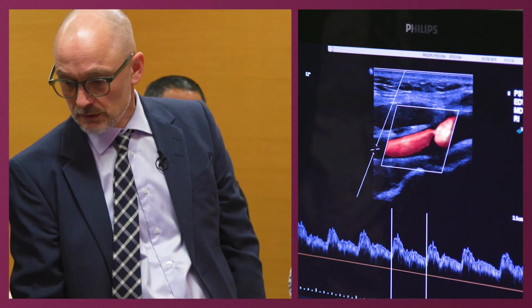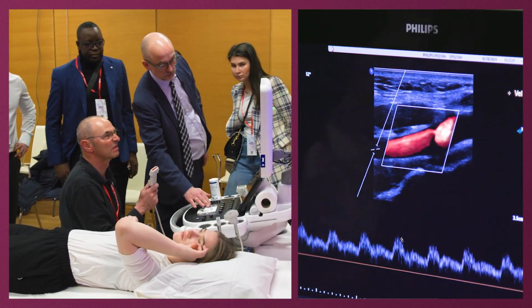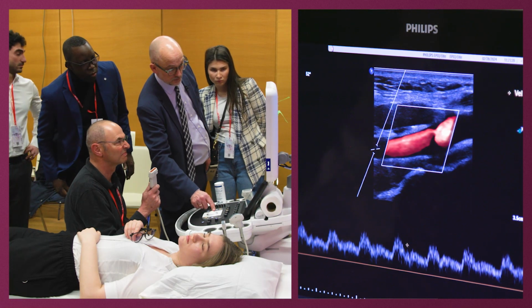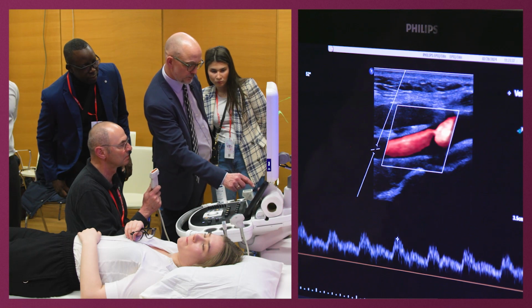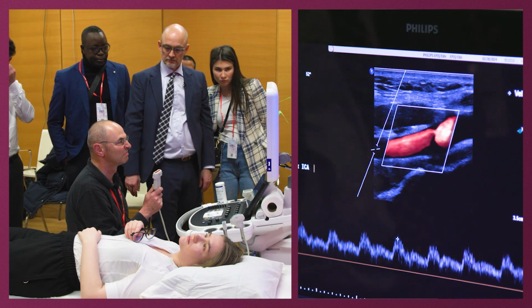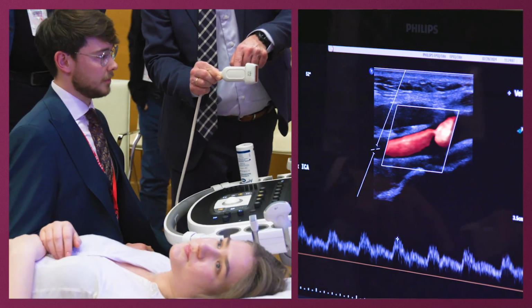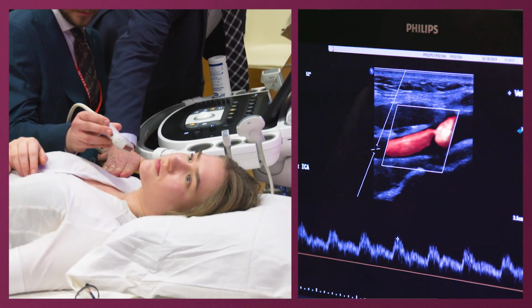You can do the measurements where you like, and then of course you should do something like this and write, no, measure proximal. I see, something like this. Save. If you look at this, this has to be cranial, or to the patient's right, like this or this. Okay.